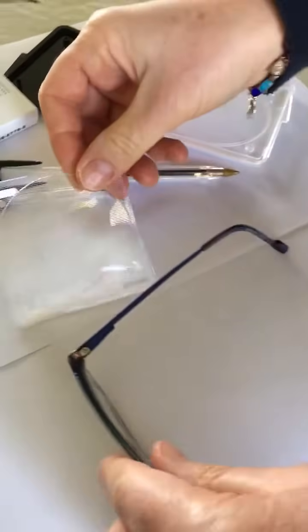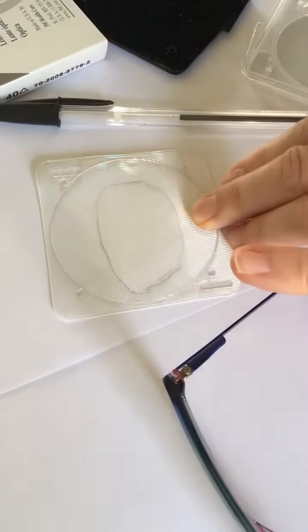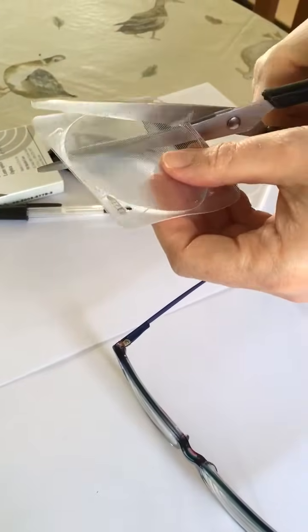Then have a look — you can see where I've drawn round there. Get some sharp scissors and cut out around your outline.